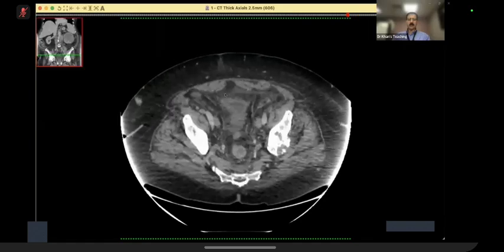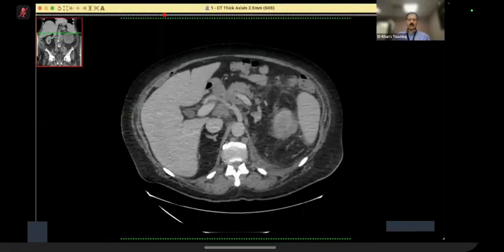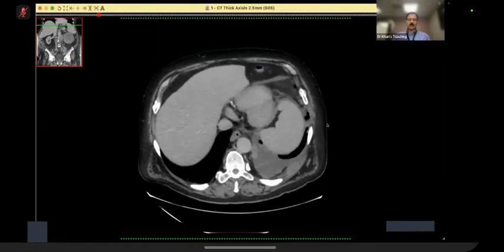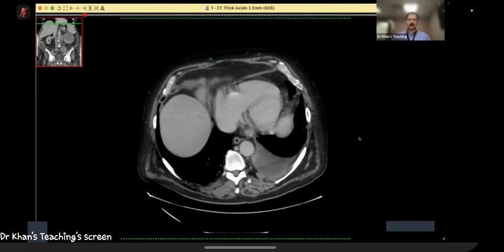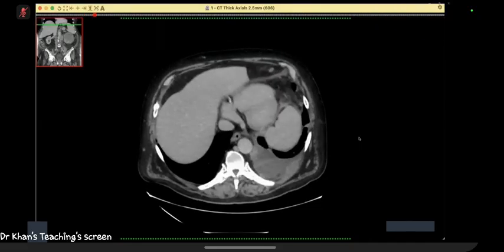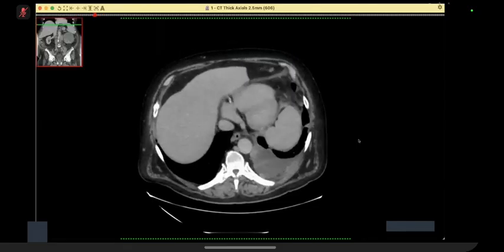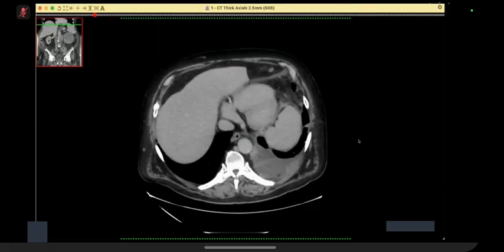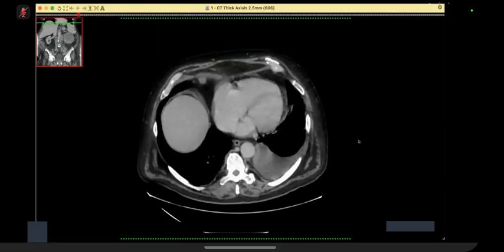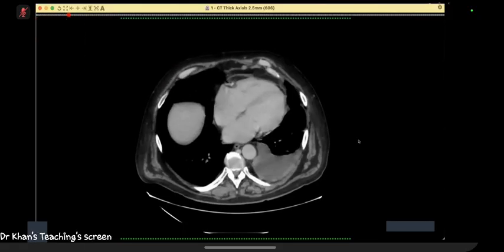Okay, I have now given you a CT scan. Because you cannot scroll it, I am going to scroll it, coming from the lung down. I can see pleural effusion and a soft tissue lesion in the intercostal region. Multiple soft tissue lesions.